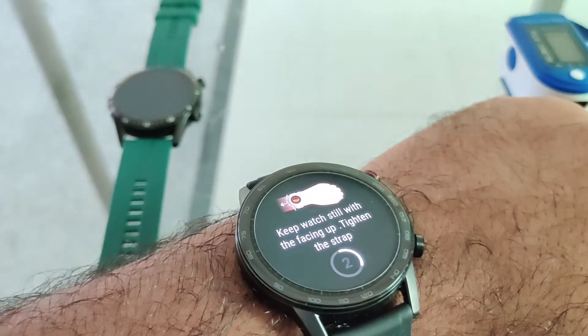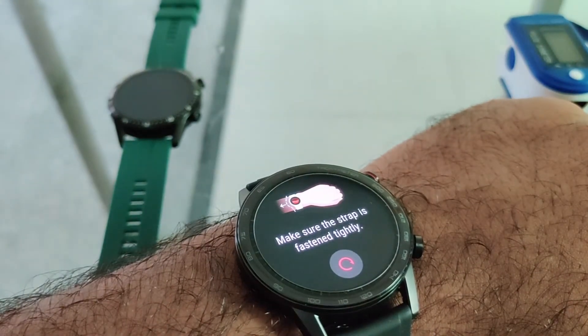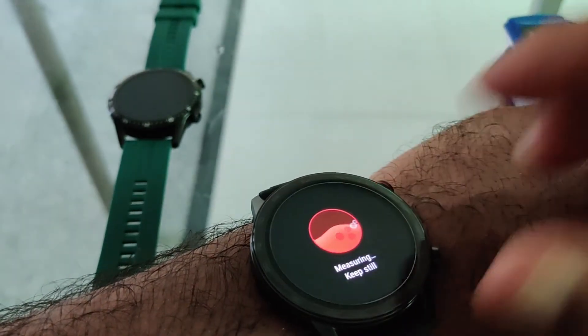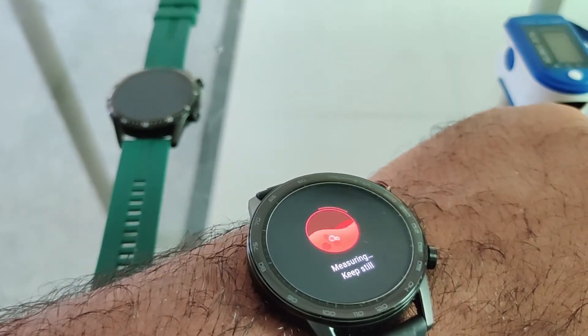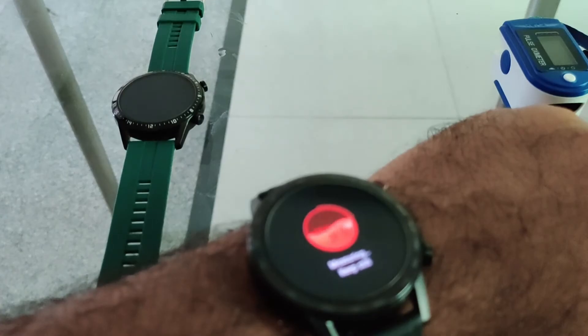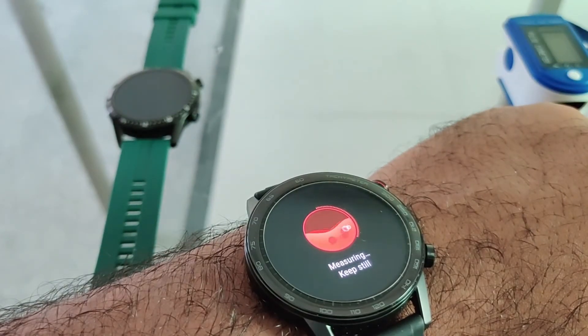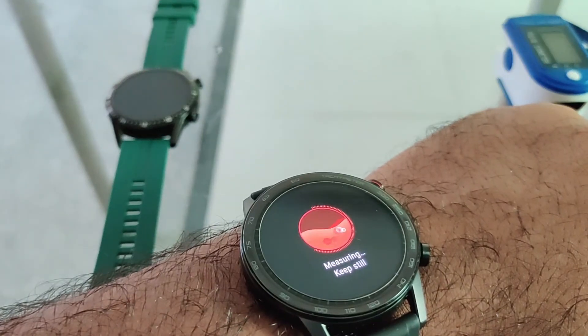You're going to keep your hand still as well as your watch facing up. In case your strap is not fastened correctly, there will be some errors in the readings. So let's try and measure one more time. It also takes very similar to the GT2 — about 15 to 20 seconds to get the first reading.